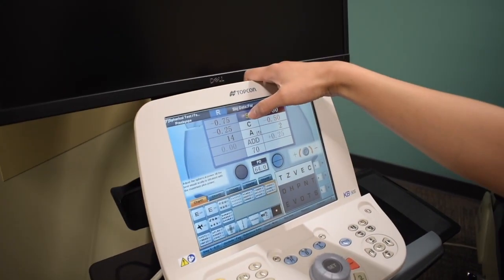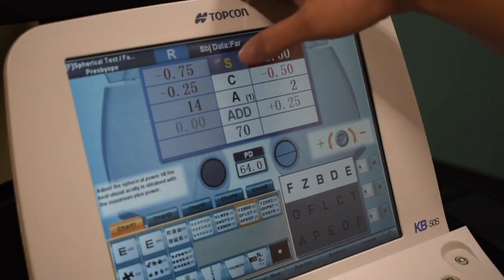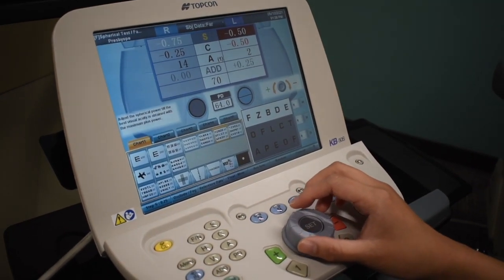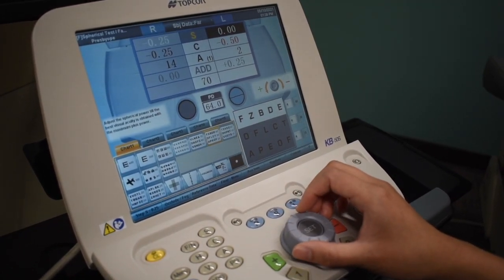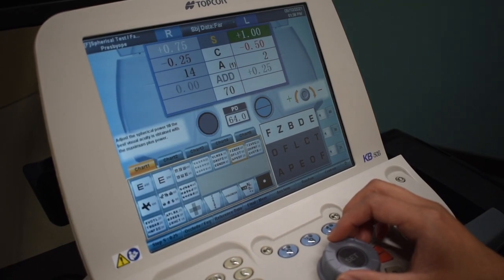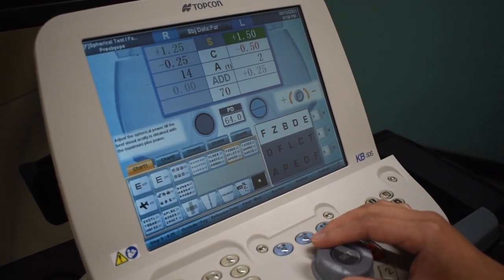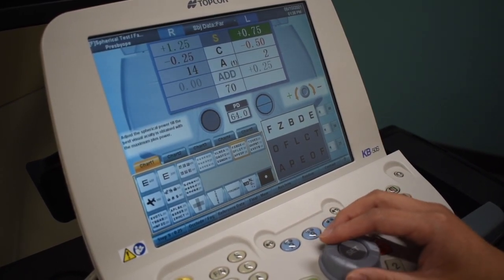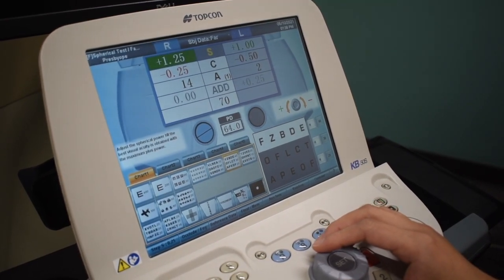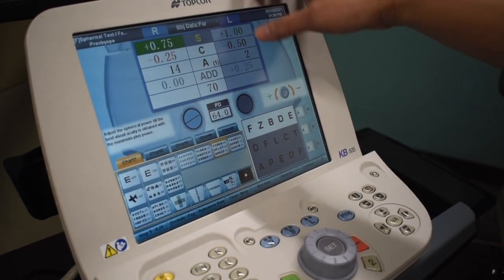Now we are going to do the 2040 blur again. Click here for the 2040 line to isolate that line. Dr. Hefner, do you see those letters? Tell me when you cannot make out any of those letters. Nothing there. Blurring a bit more, then tell me when you can see just one or two — patient sees one letter: Z. Double-checking his right eye — pretty blurry, can't see any letters. Tell me when you can see just one or two — patient sees a Z.